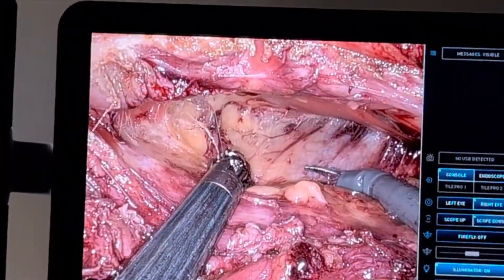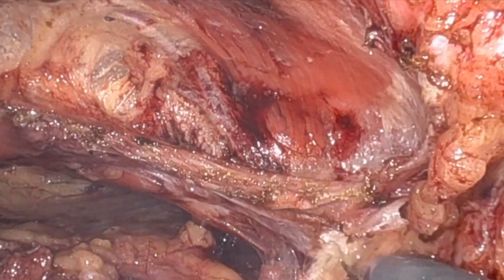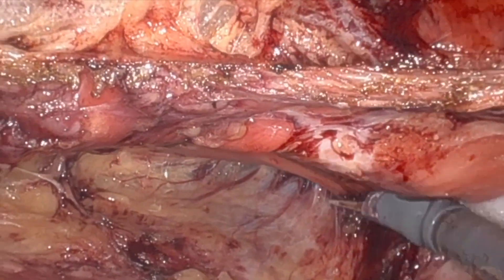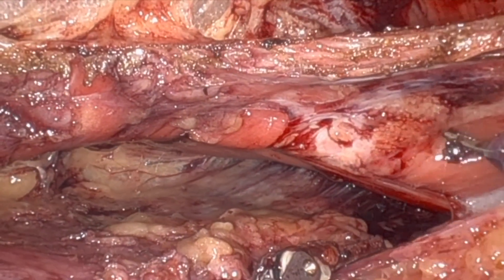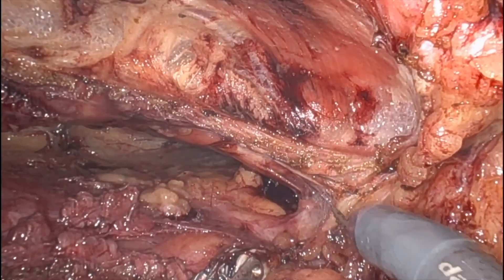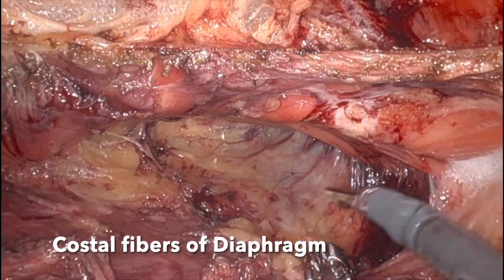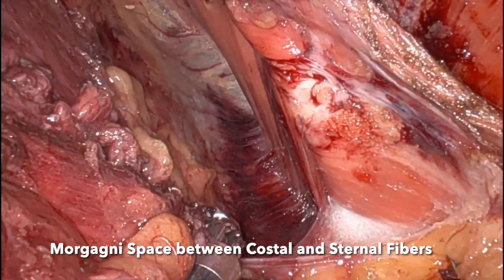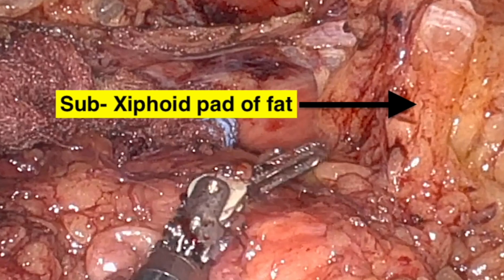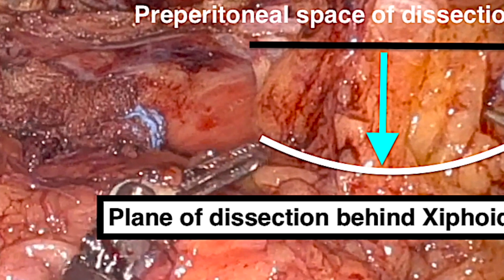Those are the costal fibres of the diaphragm and the yellow watershed zone at the 12th rib, at the junction of costal fibres of the diaphragm and the transverse abdominus muscle. Whenever you see the diaphragmatic muscles, the trick here is to stay closer to the diaphragmatic muscle. Those are the sternal fibres of the diaphragm. There is a gap between the sternal fibres and the costal fibres of the diaphragm — that is the Morgagni space. That's the sub-xiphoid pre-peritoneal fat, which is a very important landmark while carrying out sub-xiphoid dissection.